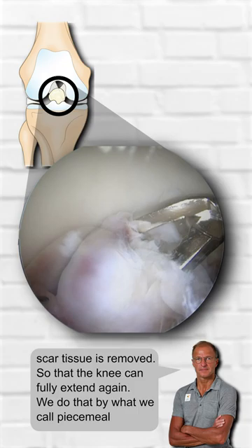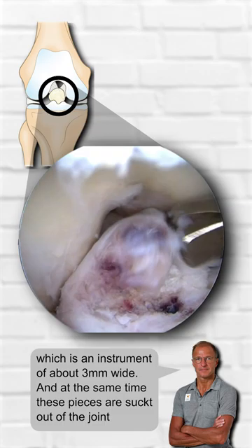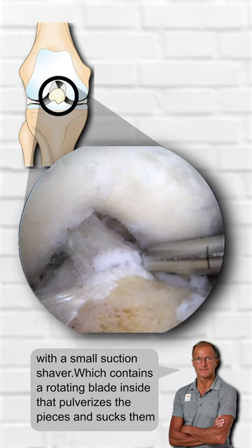We do that by what we call piecemeal resection, which means that we gradually eat away the cyclops with a surgical bite, which is an instrument of about 3 mm wide. At the same time, these pieces are sucked out of the joint with a small suction shaver, which contains a rotating blade inside that pulverizes the pieces and sucks them out of the knee.